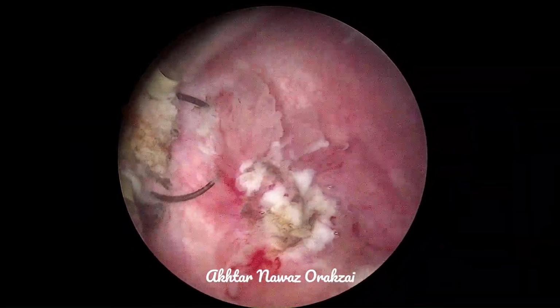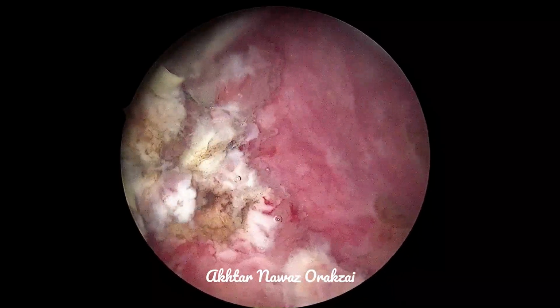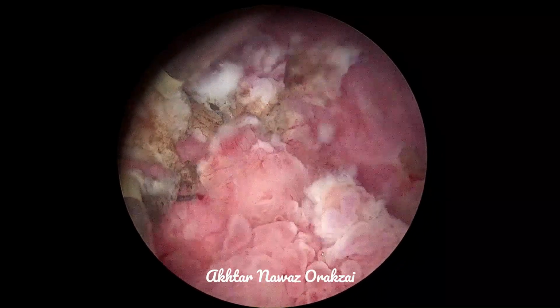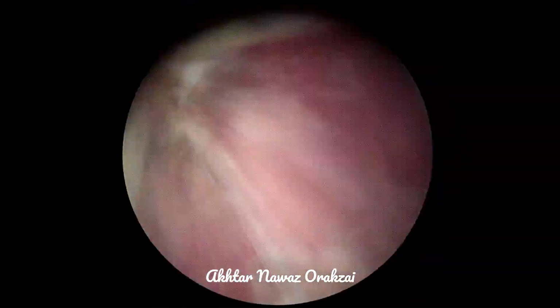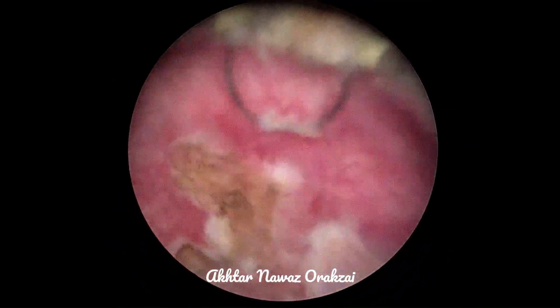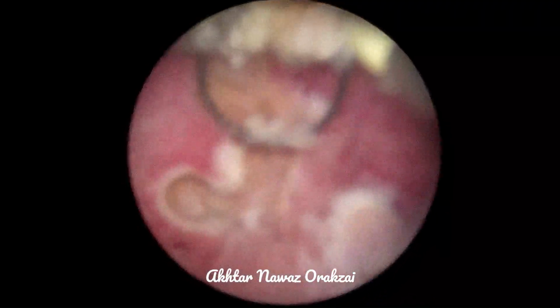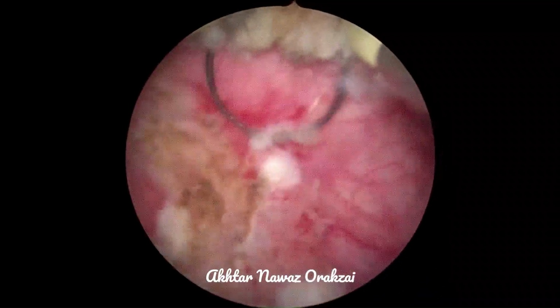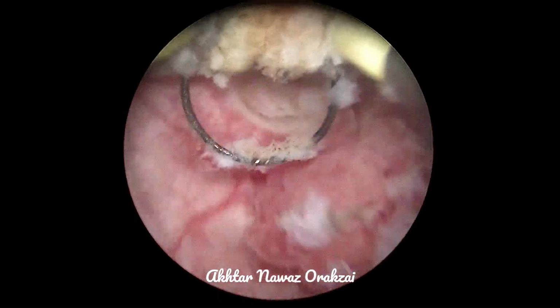So we are cutting the mass when some portion of the loop is visible to us, not blindly. We are not trying to go deep, because the deeper tissues will be taken later on when we clean all these resected tissue with the Ellik evacuator. Meanwhile, correcting the focus of the camera.